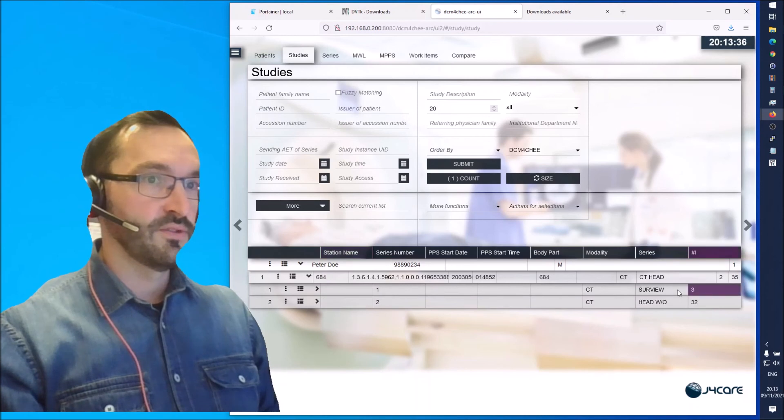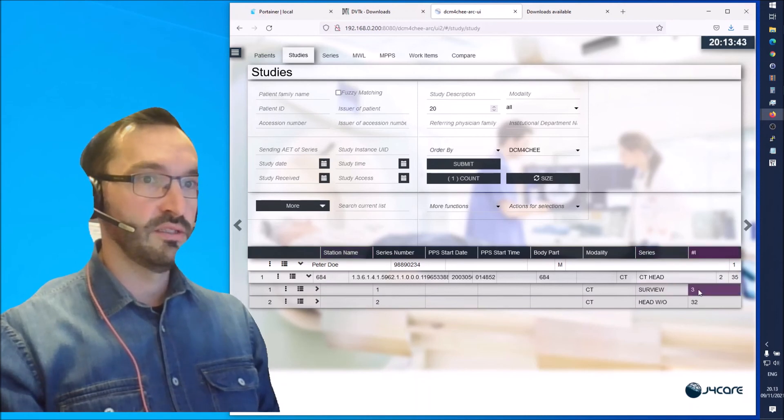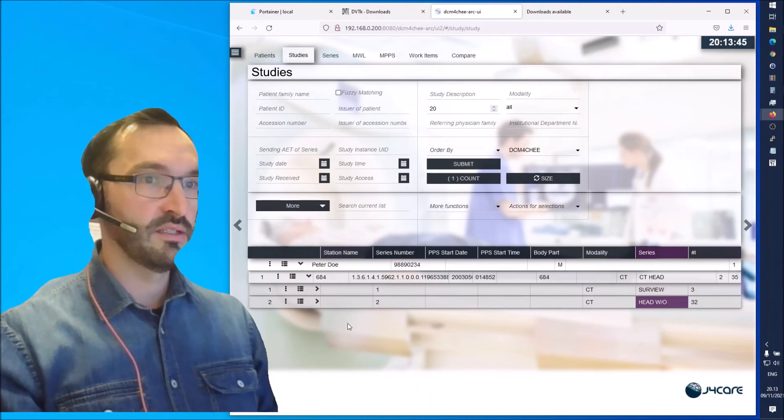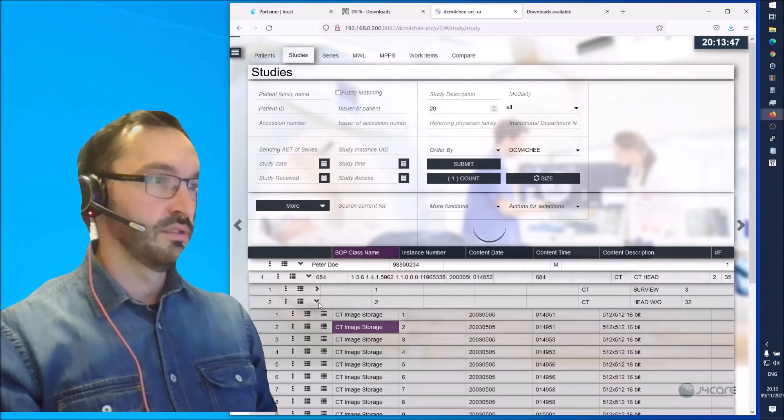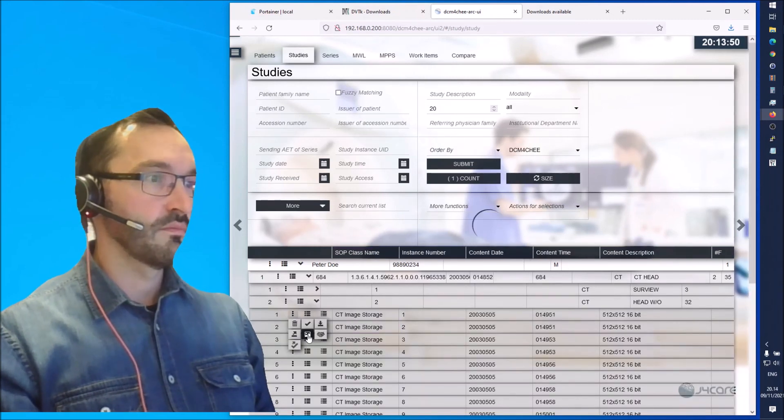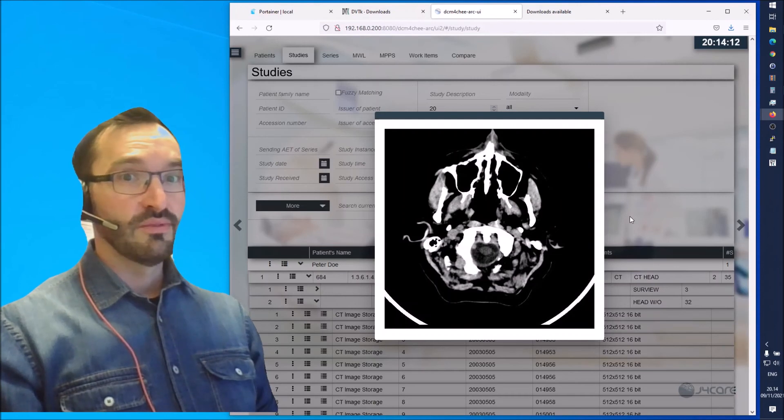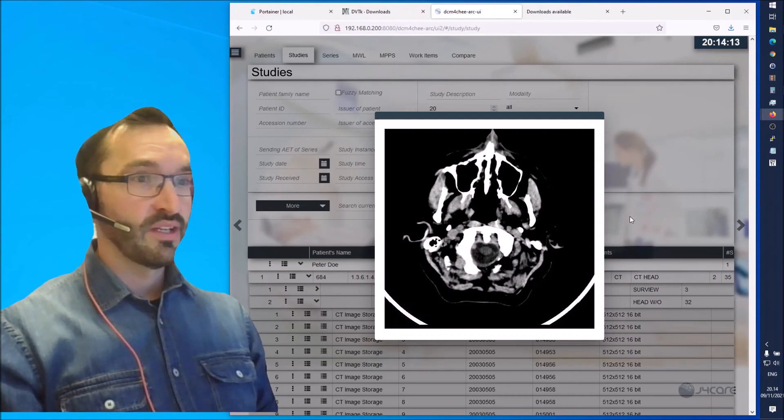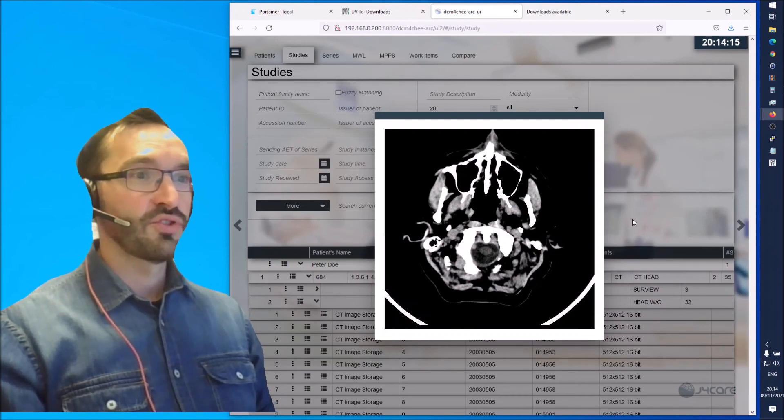So now we can see two series. The first one is a survey, three images, and then we have the head series with 32 slices. Let's check the images here. So this is how you can send studies to the Daikon4G VNA.